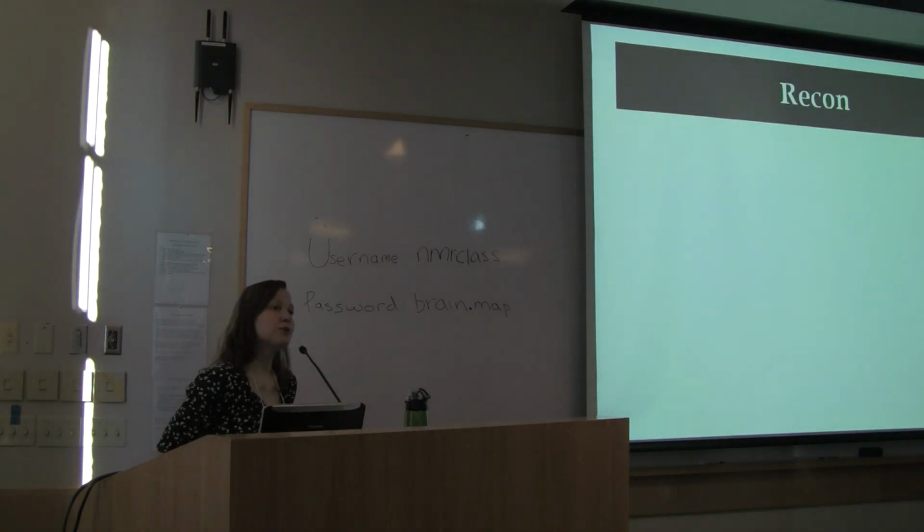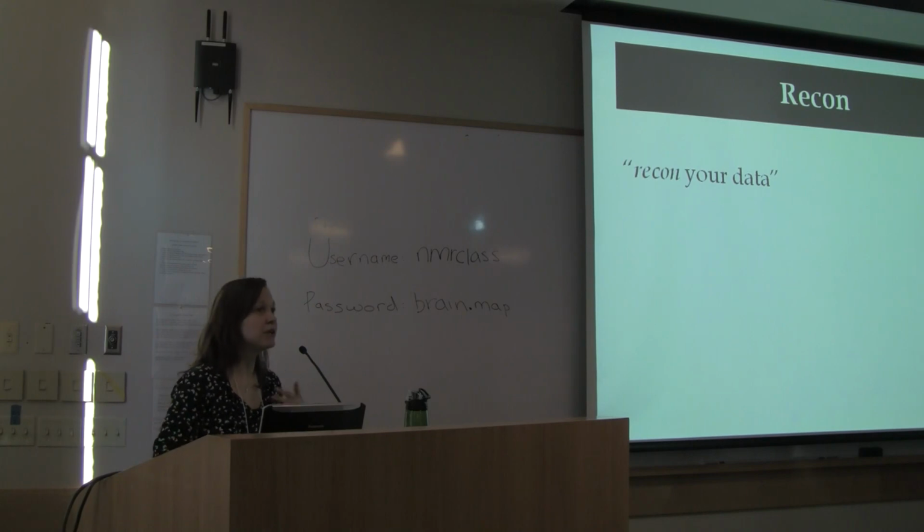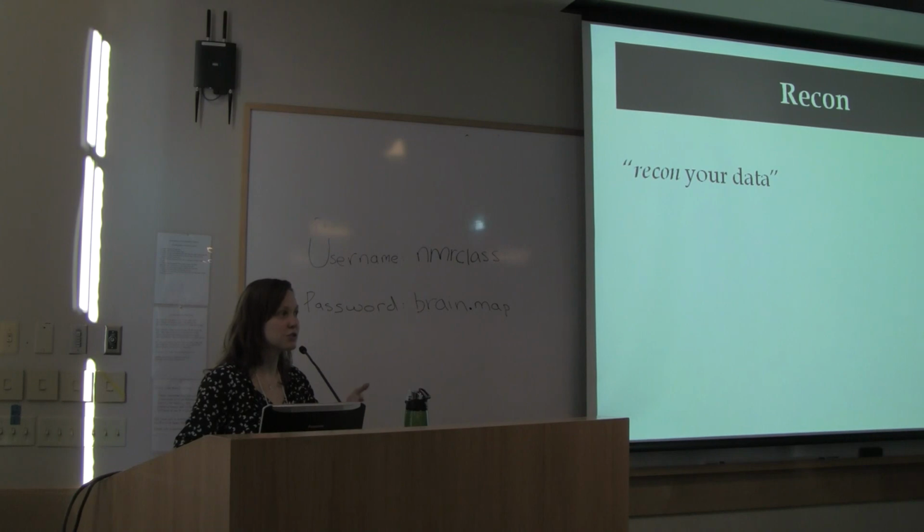We'll also say the word recon a lot. Recon can refer to a couple of different things. We might say, check your recons, and in that case, we're talking about the outputs we got from FreeSurfer. We might say recon your data. We use it as a verb, and that means actually running it through the processing stream.